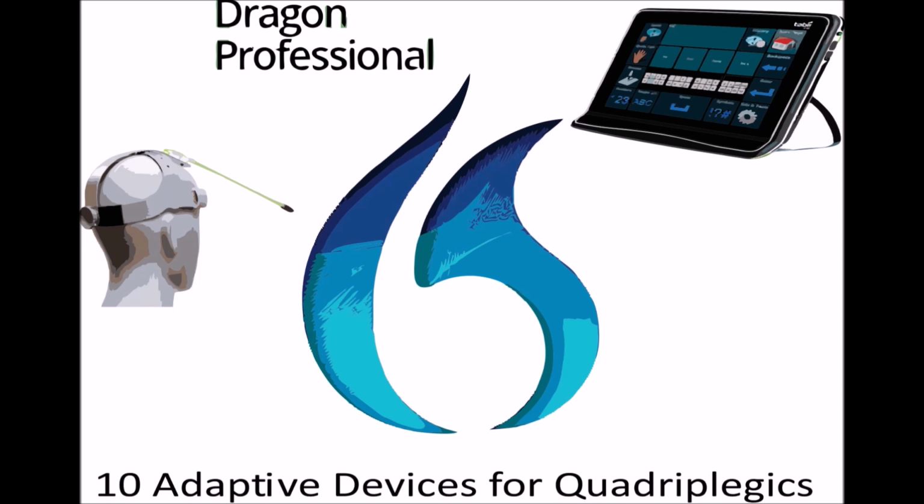Sip and puff systems are especially useful for individuals with spinal cord injuries or other disabilities that affect their ability to use their hands or arms. They can provide greater independence and autonomy, allowing these individuals to control their environment and perform everyday tasks more easily. Sip and puff systems can be customized to fit the individual's specific needs and preferences, such as the sensitivity of the system and the type of commands or inputs used.